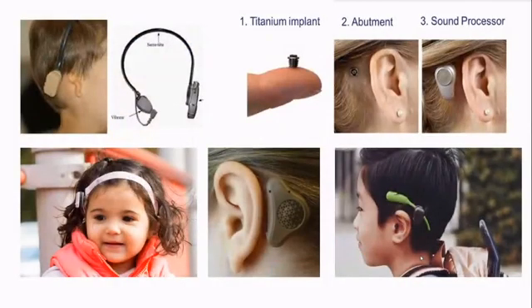This is how it looks on a patient with a bone conduction hearing aid. In this tiny girl, it is like a soft band. This is what we call a soft band BAHA. It doesn't require any surgery, but eventually she will need a surgery. This is just to make her get used to having this bone conduction hearing aid on her, and how it amplifies the cochlea.